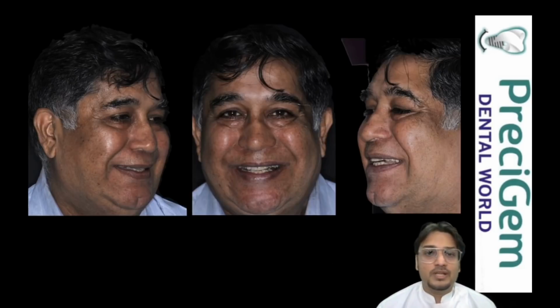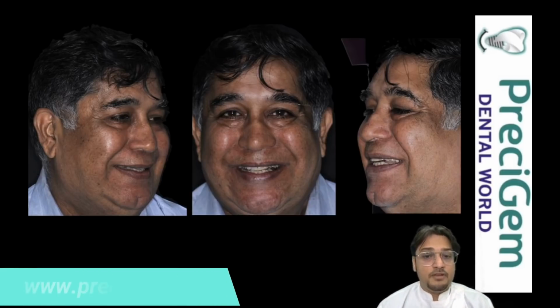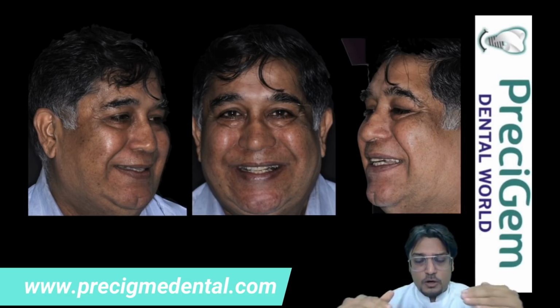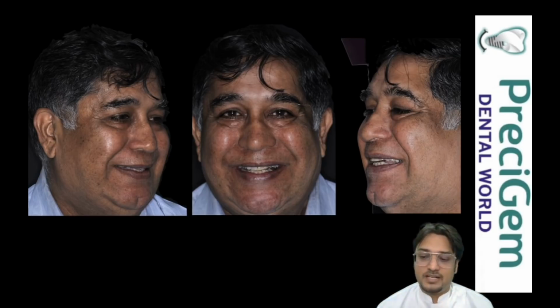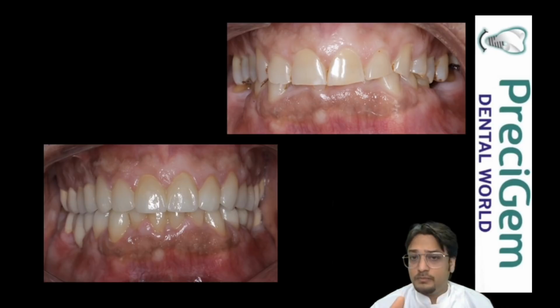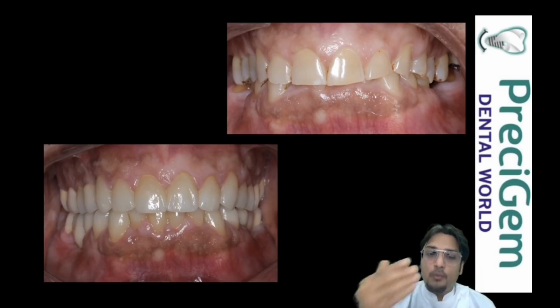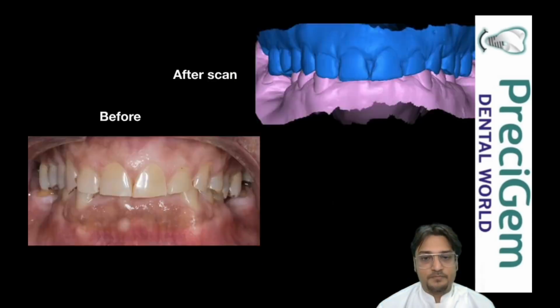So let me continue with the case. This gentleman came to us with totally untreated teeth, and we took smile pictures in front, right and left directions. You can see there is a lot of space loss. So we decided to design this case with digital smile designing protocols. These are the before and after results, but I'm going to tell you in detail, step by step, how we define this and convert back to the original ideal shape.